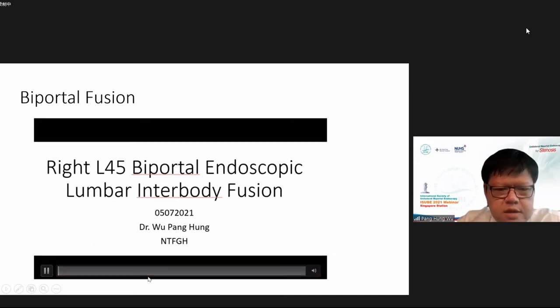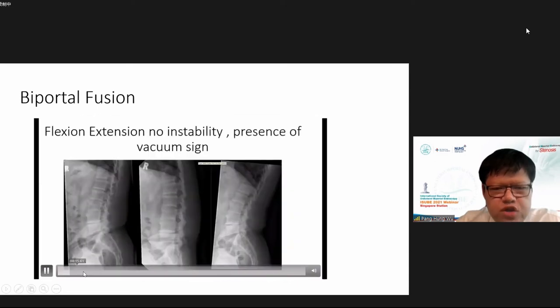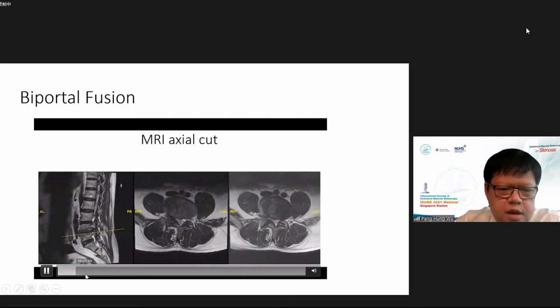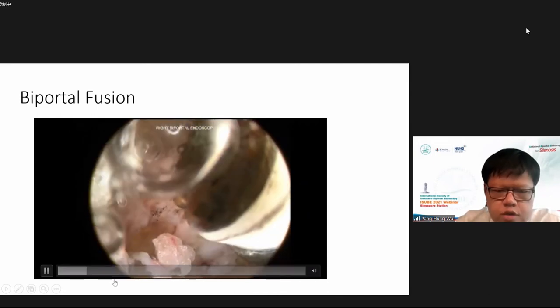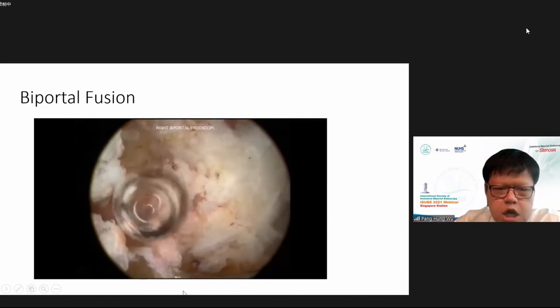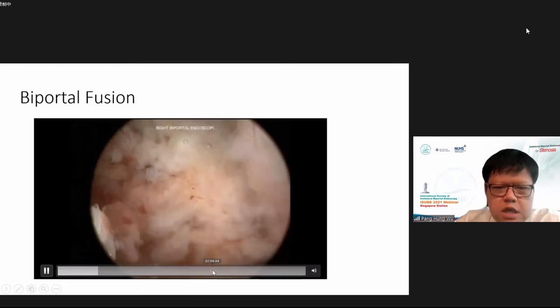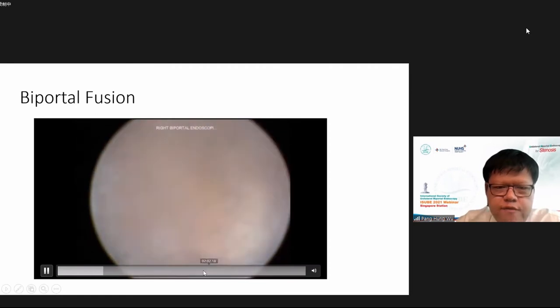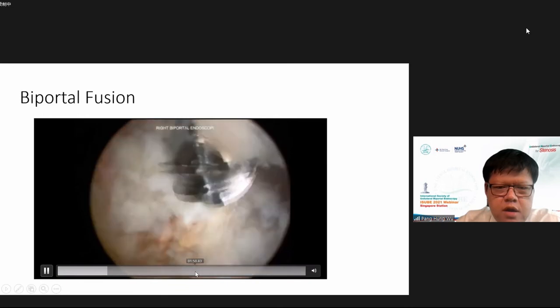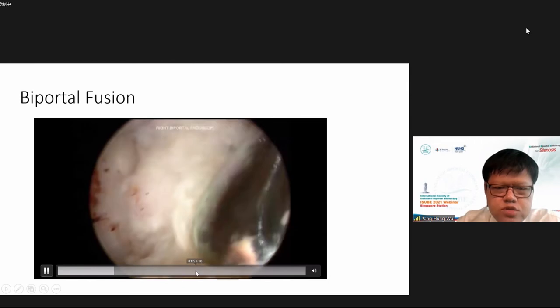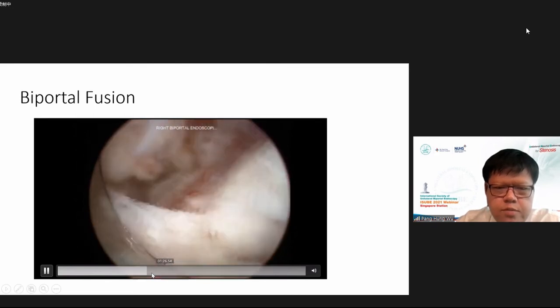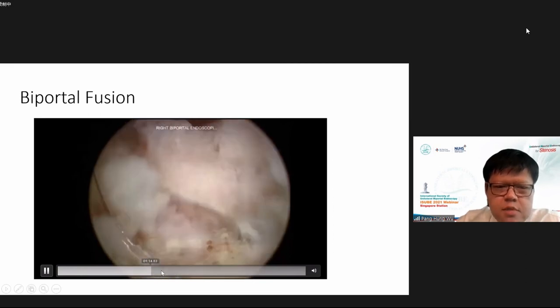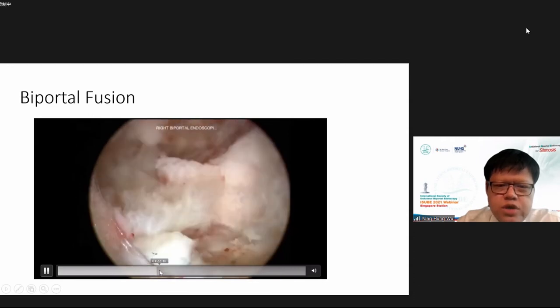This recent case is a right L4-5 fusion. In earlier cases, I placed a spinal needle on the opposite side to avoid disorientation, but no longer need to. This type of biportal surgery is quite efficient — you can use osteotomes and harvest more bone graft. I make a line with the cutting burr first for orientation, then drill on the facet capsule to loosen it up. I use the osteotome to perform a straight cut osteotomy of the inferior articular process.